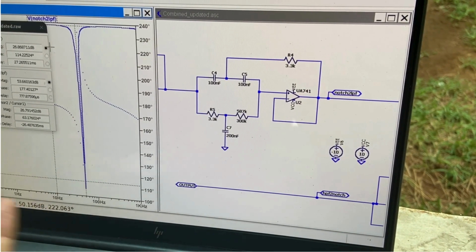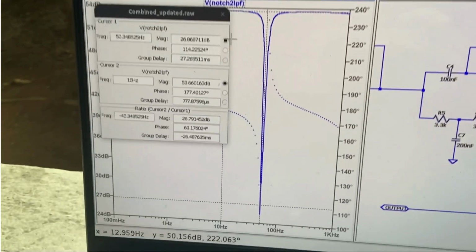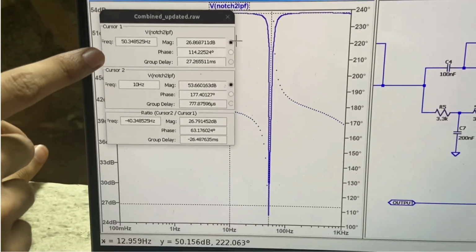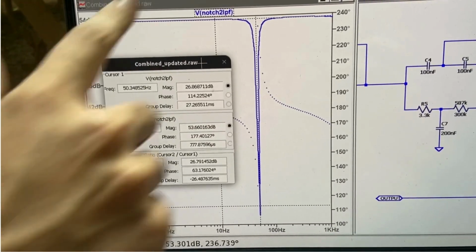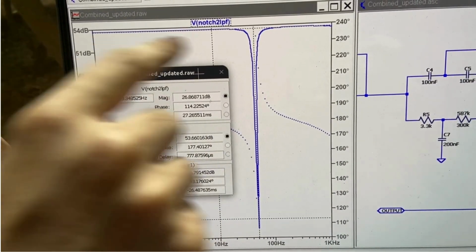As can be seen from this plot, the cutoff frequency in our simulation is around 50.3 Hz, and it has a very good notch shape over here and provides almost zero gain.